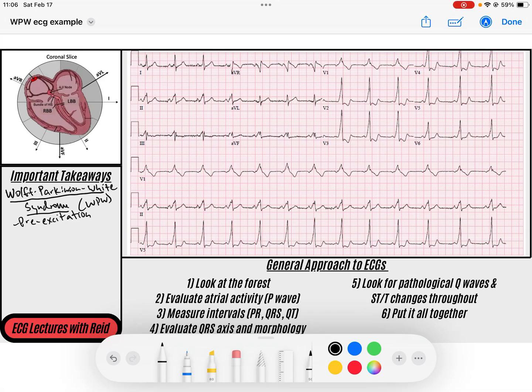Hey everybody, welcome back to the ECG channel. In today's video we're going to be talking about Wolf-Parkinson-White Syndrome, or WPW Syndrome. This is a syndrome named after three doctors, but really the concept of Wolf-Parkinson-White is this concept of pre-excitation. We're going to talk about the mechanism behind pre-excitation and how it displays itself on ECGs.